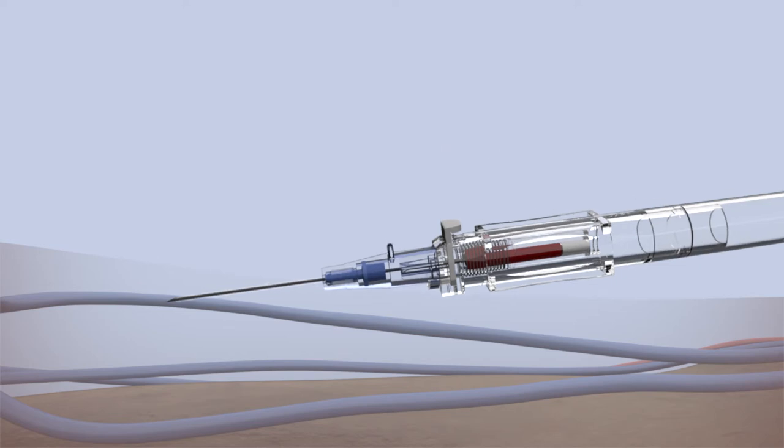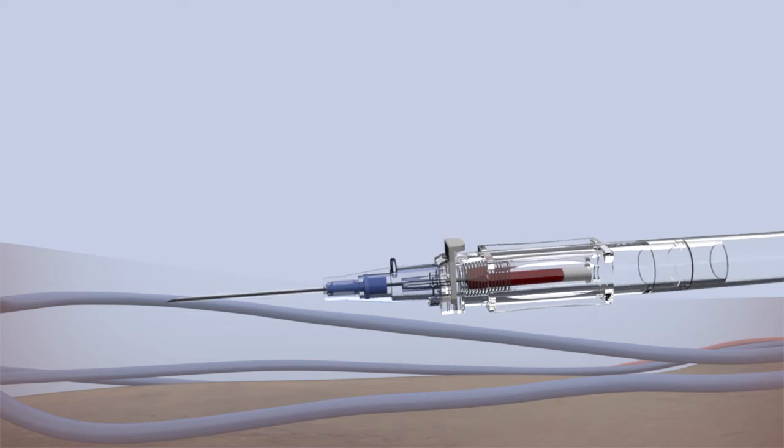Decrease the angle of insertion further, such that the catheter is nearly parallel to the skin surface.